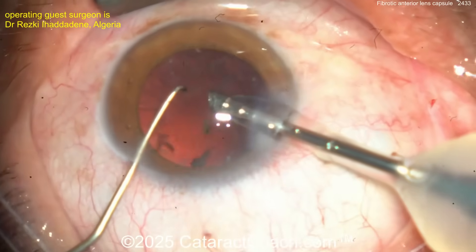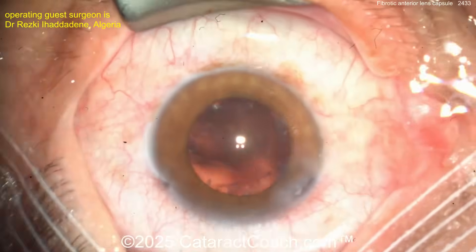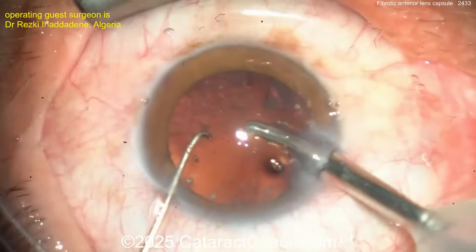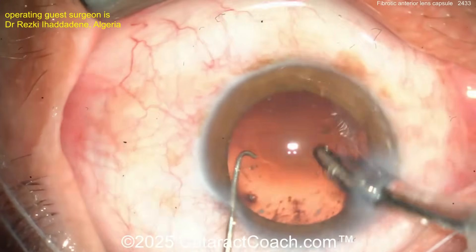Slow-motion phaco for these last few pieces — slow, slow, slow. As they say, slow-motion phaco is sometimes the best thing. Look at that — finally some light gets to shine on the retina. Whoosh — that retina hasn't seen light in a while.